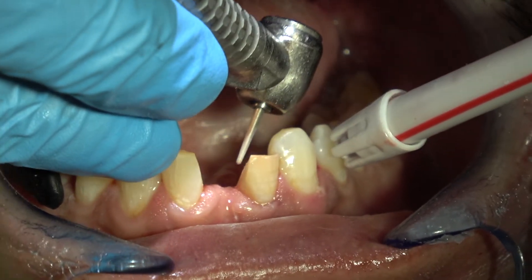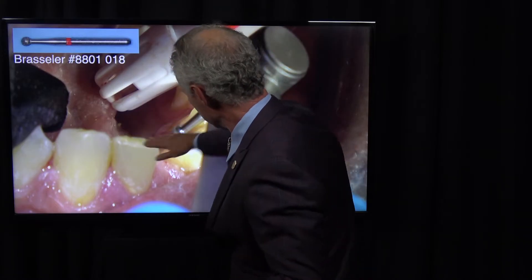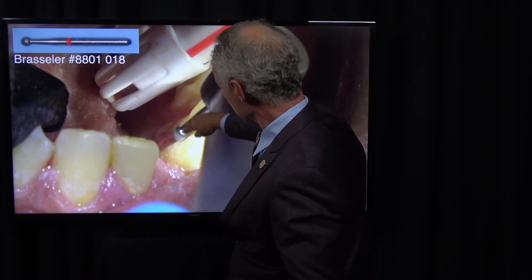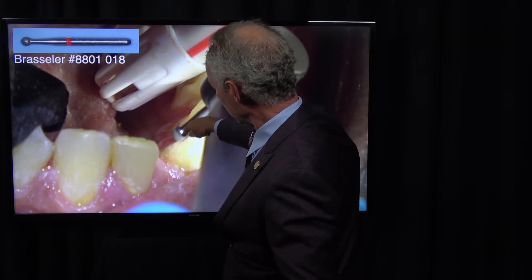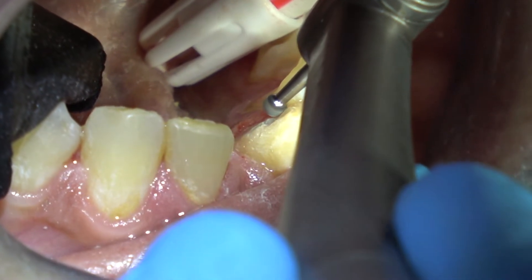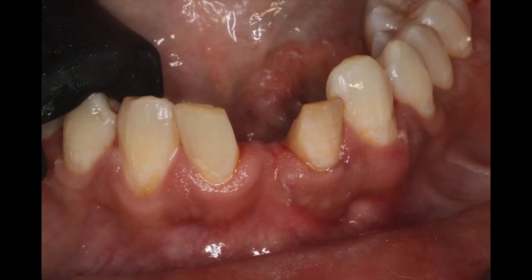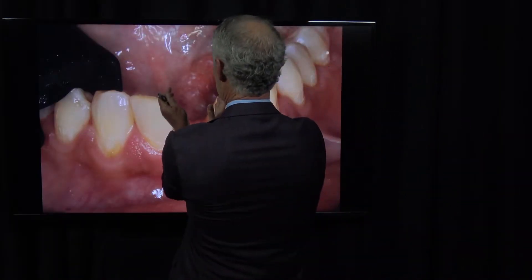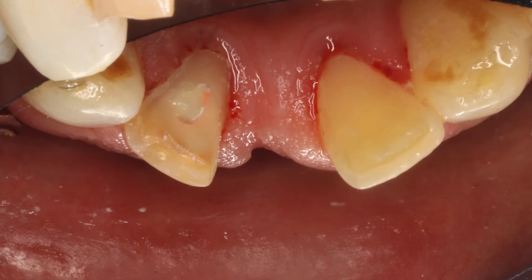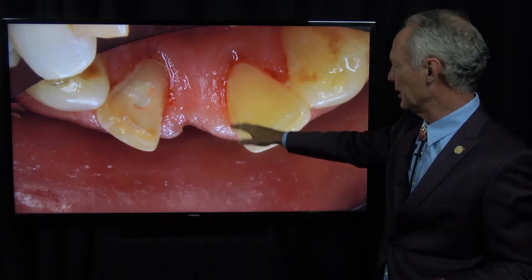Just a light touch around the line angles. Now I'm creating a little stop on the lingual - not just a ski slope. I want a little slot, using a round burr to create a little ledge on the lingual so the bridge will stop when seating it, much like the stops on bicuspid teeth when prepping veneers. Since it's not in the aesthetic zone, I'm not worried about creating a gingival pontic receptor site - I don't need the pontic to look like it grew out of the gingival tissue here.